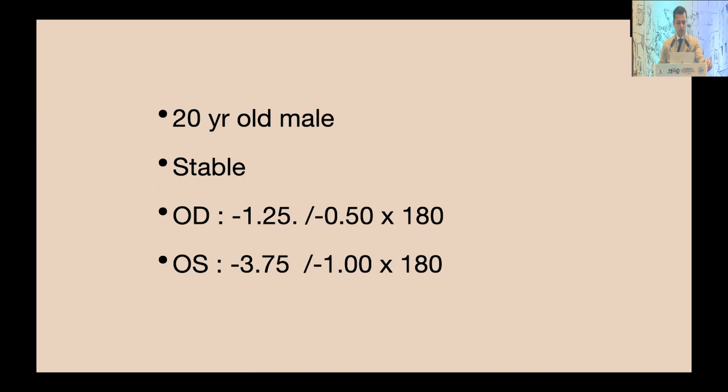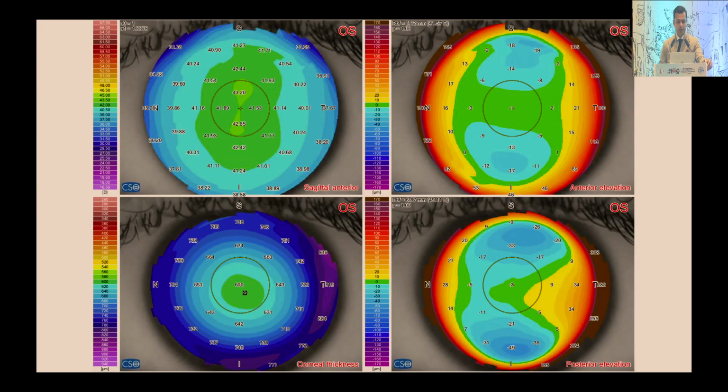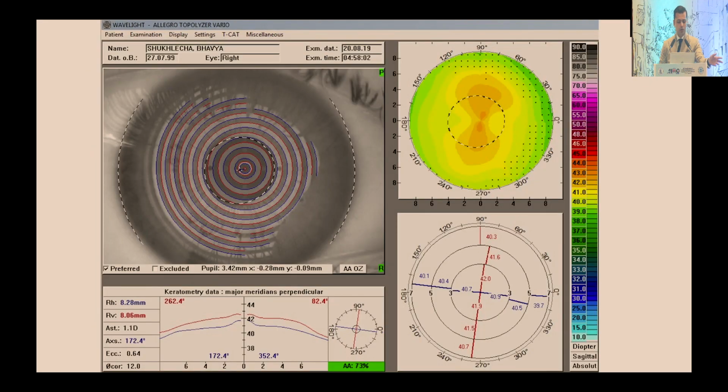Again, a case scenario, just to show you a 20-year-old with stable refraction, slight anisometropia, and this is the preoperative topography. Like it was discussed in the previous talk, I use a mix of Placido topography with Scheimpflug because the anterior corneal curvature comes out better with Placido. And I decided to do a Contoura treatment on this patient. This is how the capture looks like. You get the pupil, you get the visual axis, and you get a lot of data.